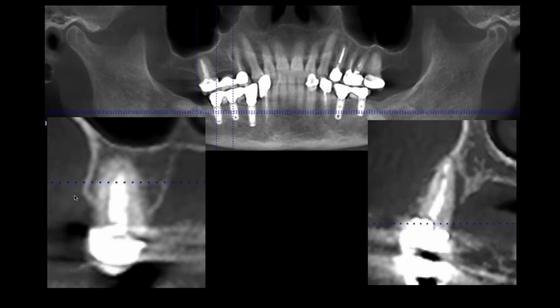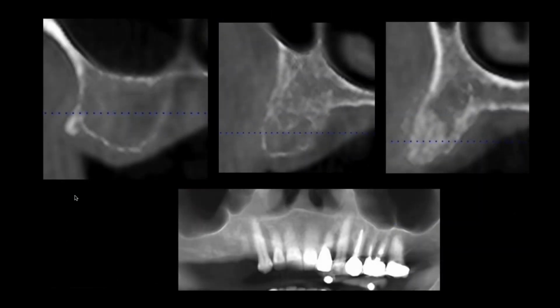So who would I see? This is a normal, everyday type of occurrence. Patient comes in, she's going to lose on the maxillary right side, teeth number 3 and 5. And these are fractured. They need to be removed. She's having a mitral valve replacement as well. So I removed the teeth because we didn't want to have the infected teeth when she has her valve replacement. And then you see about a year later, she comes in, and we got a little porosity going on in the bone. So we'll use appropriate drills.